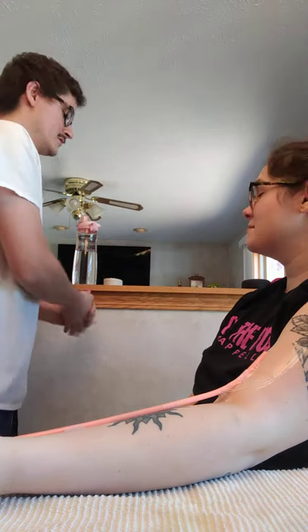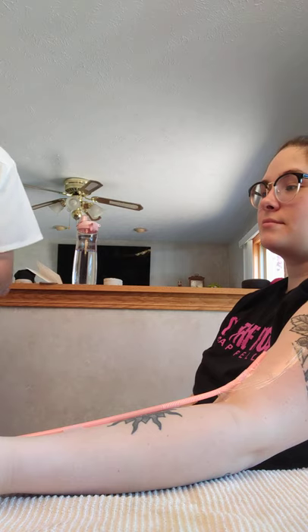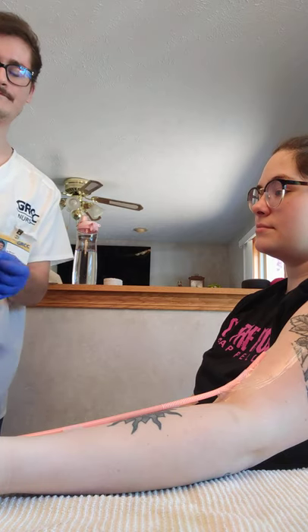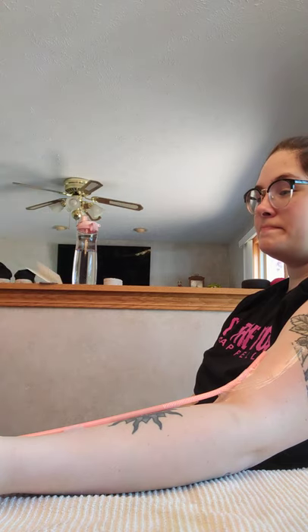Good morning. I'm going to simulate washing my hands and provide some privacy. I'm going to put on some gloves. These are clean gloves. And then don my mask.